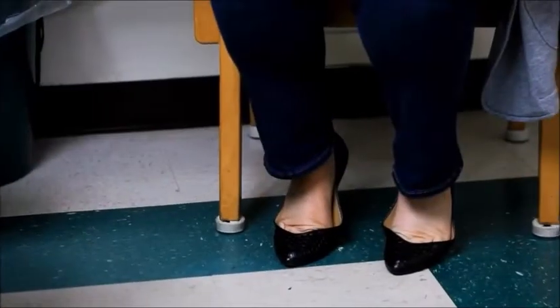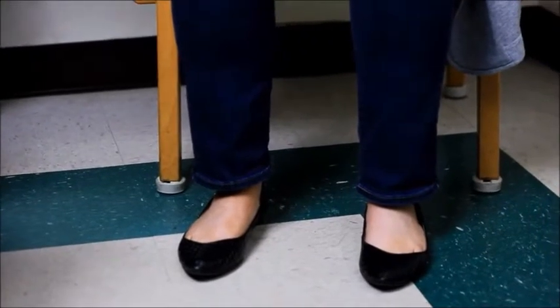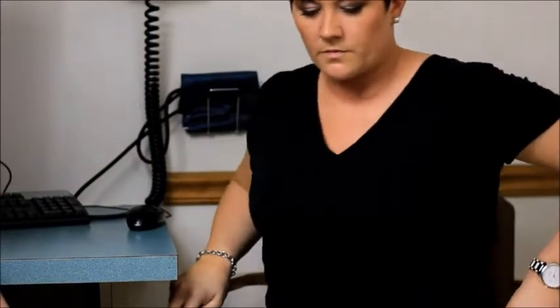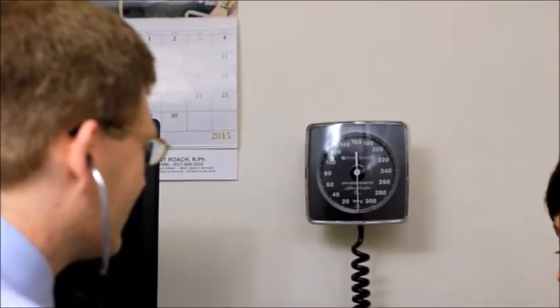The patient must be correctly positioned to accurately measure blood pressure. The patient needs to have legs uncrossed and feet resting on a firm surface. The patient's back and legs should be supported by the chair. The manometer should be at eye level of the care team member. The patient's arm should be supported at heart level.